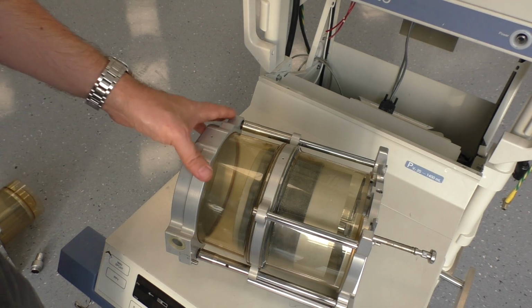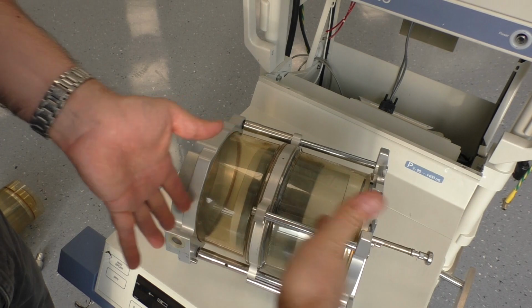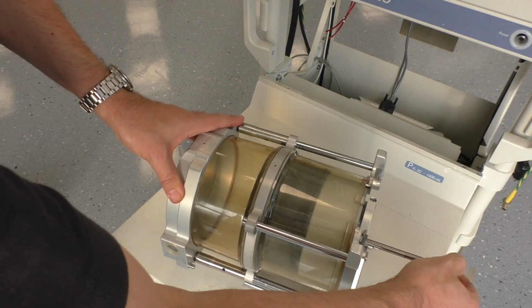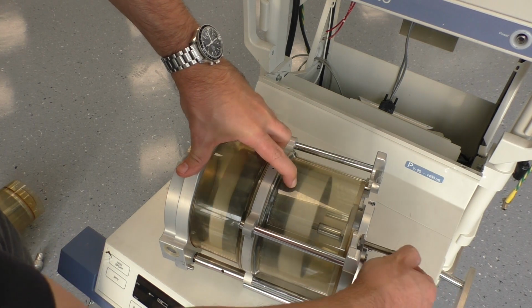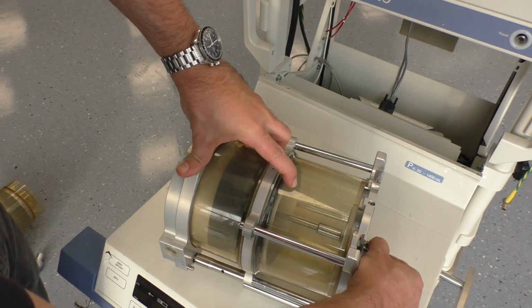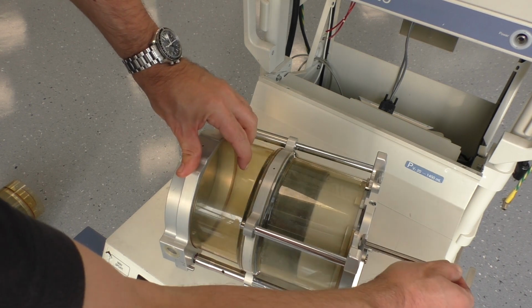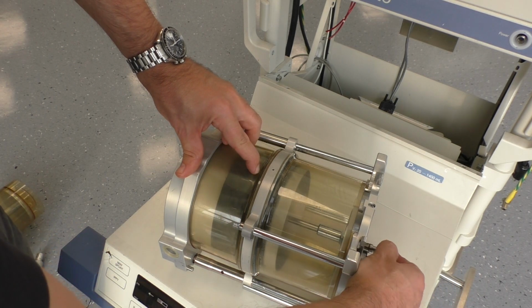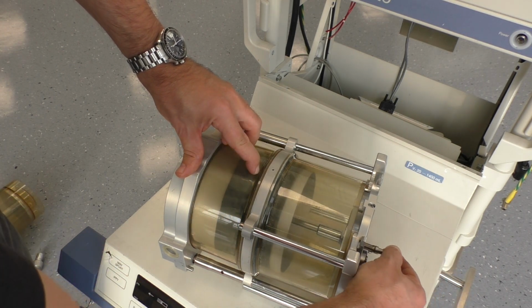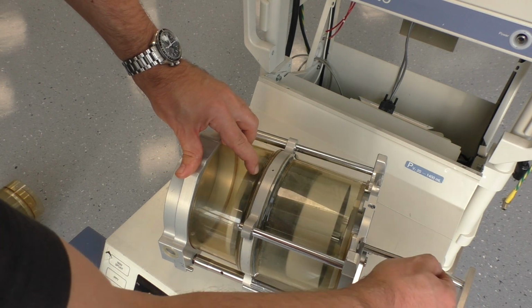So this here is a little bit unexpected. I expected to have a bellows that folds up and down, but this is more like a piston pump, but it has a rolling rubber gasket here, which rolls around the inner piston and seals it completely. So that's the way the gas mixture is pumped.